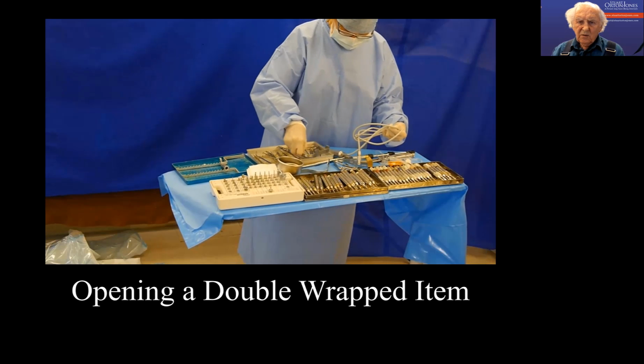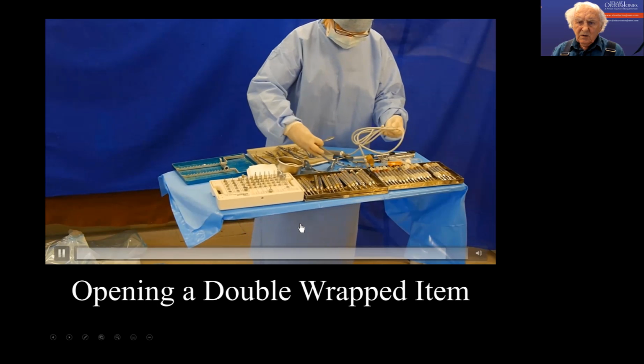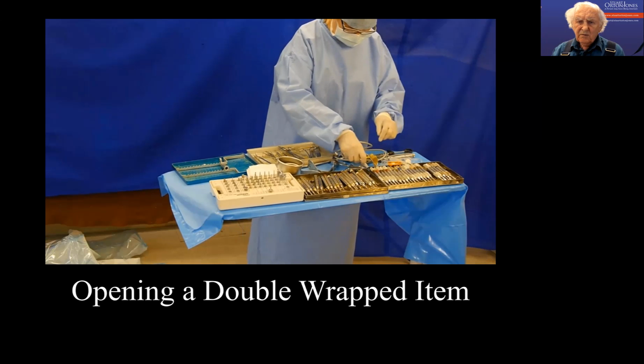And once this is all set up, she's going to move that Mayo table round over the patient.